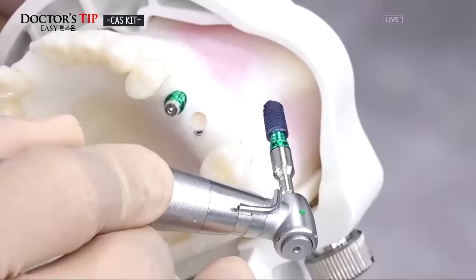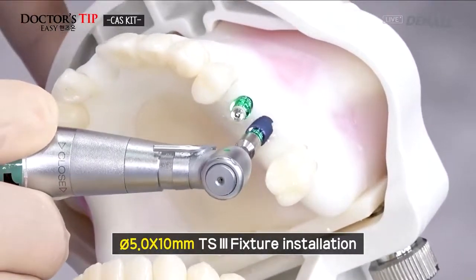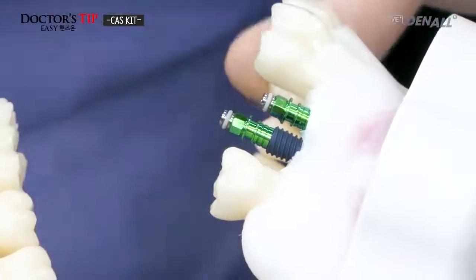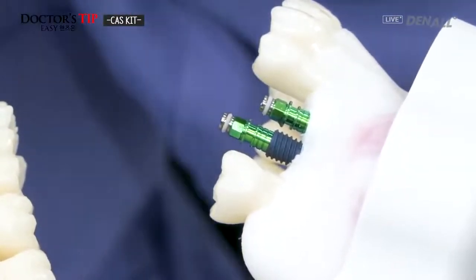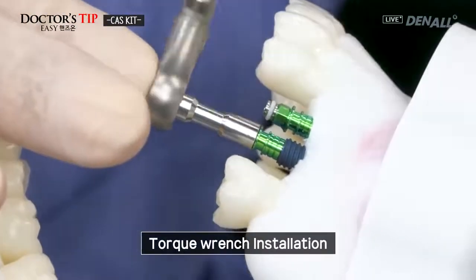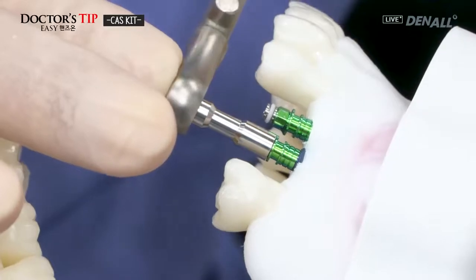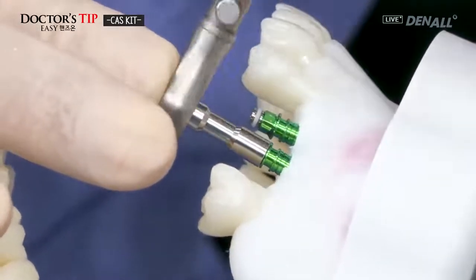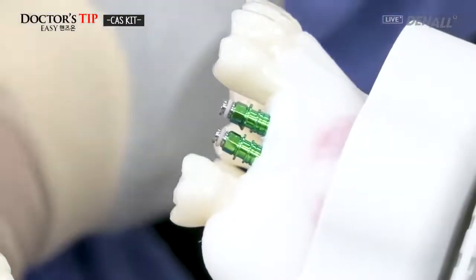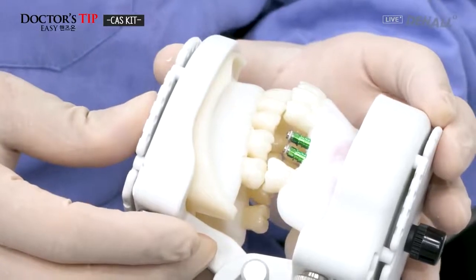Now, a 5.0 by 10 millimeter fixture is placed. The bone is very hard because it's a model. Now the implant will be placed on the final stage with the wrench. The stability is good enough. 1 millimeter under drilled. The fixture is placed. Relation with the opposing teeth: they are properly placed as we wanted.